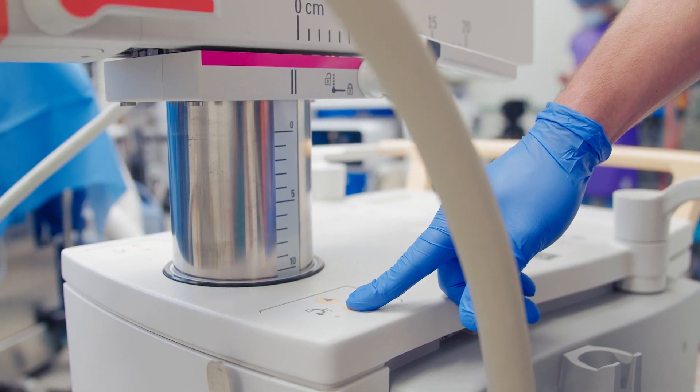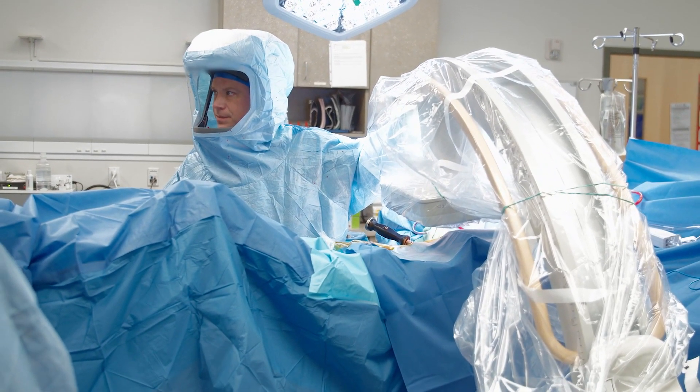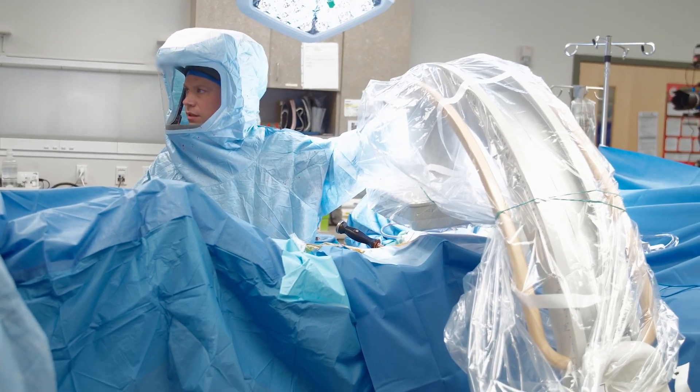The Zenitian offers me ease of use. Even I as a surgeon can direct the movement of the C-arm due to the counterbalance capability, where the tech can leave everything unlocked and I can easily maneuver it into place on my own from the operative field.